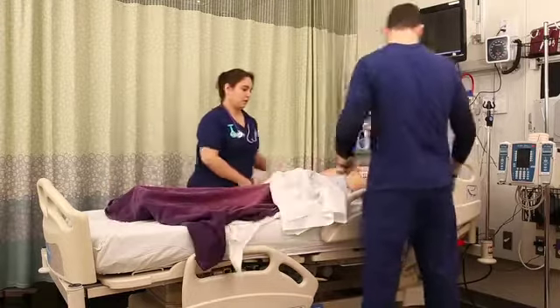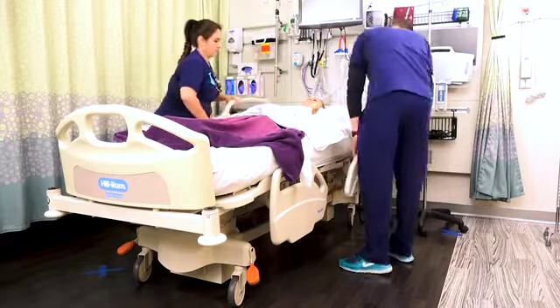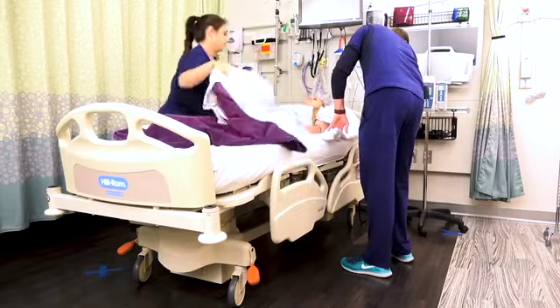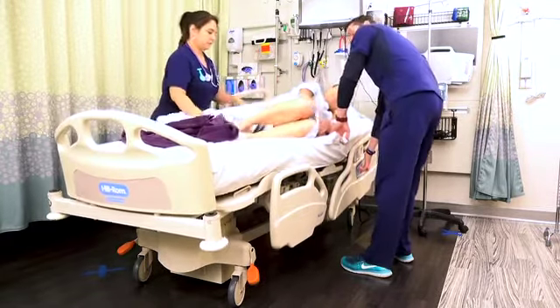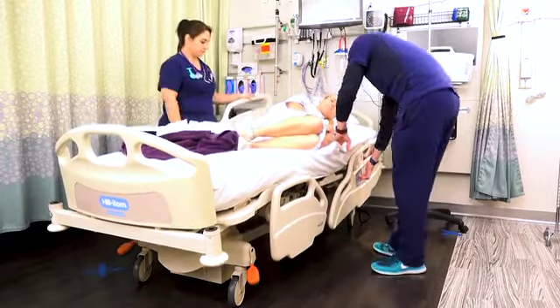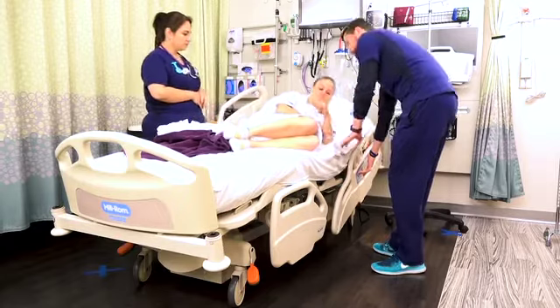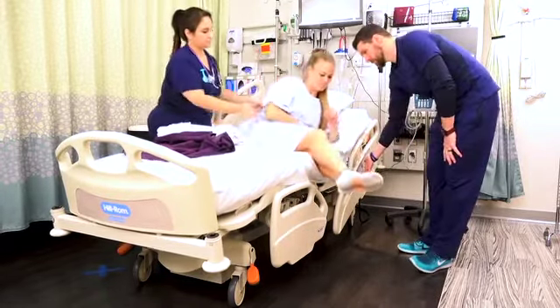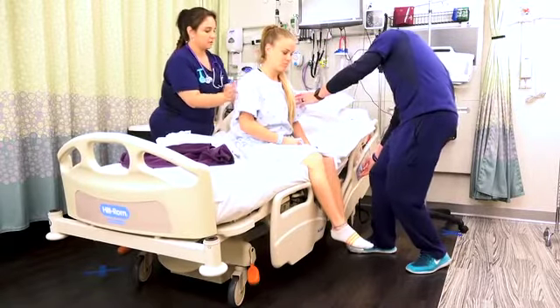Now, let's say we want to get the patient out of bed. First thing we need to do is put the side rail down and have the patient turn towards you onto their side, and of course, put the bed down lower to the ground. Once we're ready, we want the patient to lift themselves up onto their elbow, and then turn up to sitting as they swing their legs over the side. And you can help them move their legs if needed.